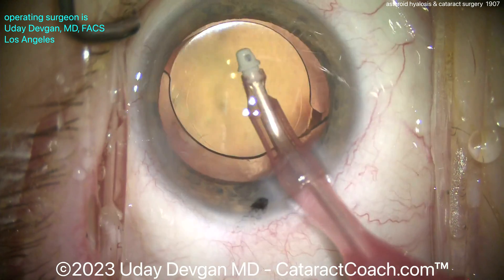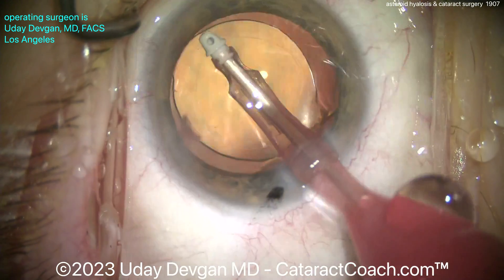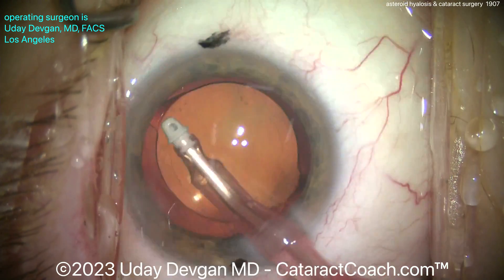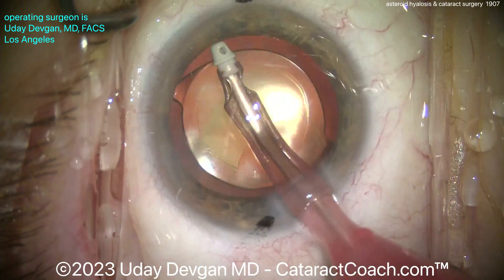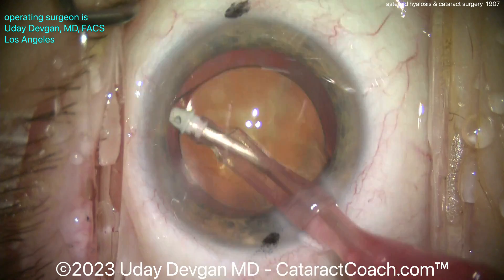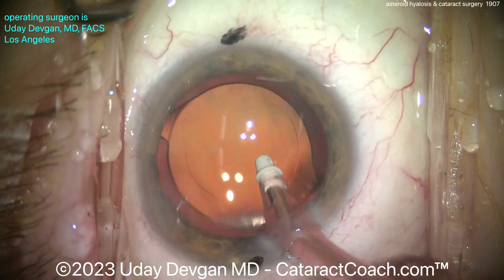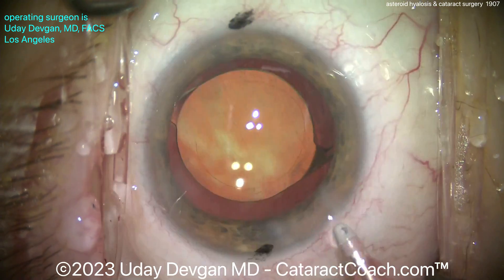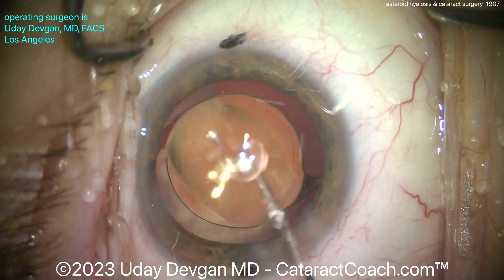There are cases where some patients with asteroid hyalosis do get a vitrectomy. It's an uncommon condition — estimated at only about one to two percent of the population — and can be seen more frequently in older populations. Among my patient population, I'd say it's about one to two percent, so I see a patient or so with this condition every month, which is pretty typical. Look at all those opacities — when you move the eye, they move around, and surprisingly patients just don't notice it.